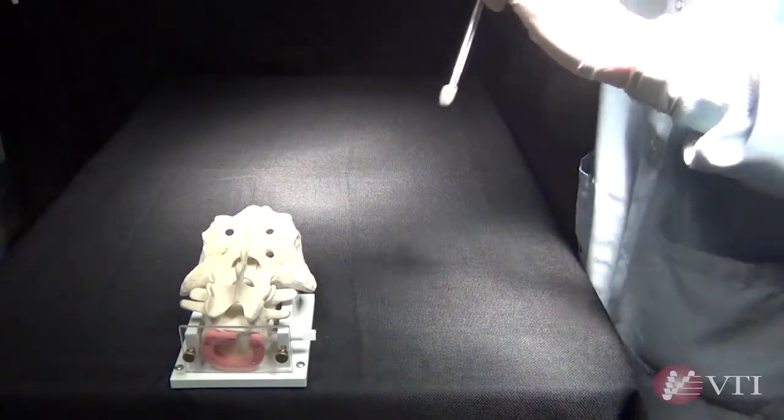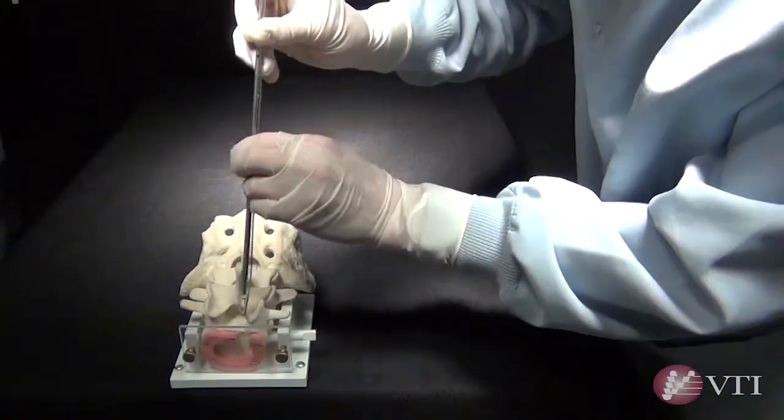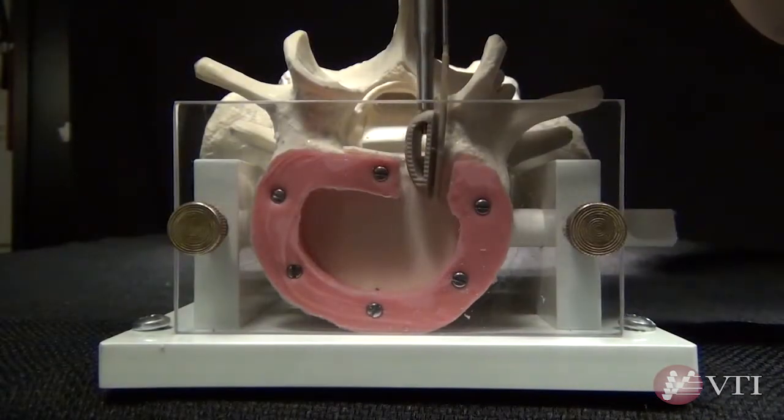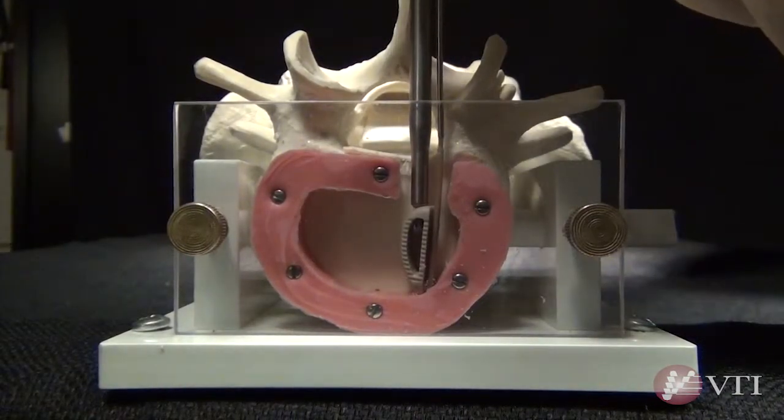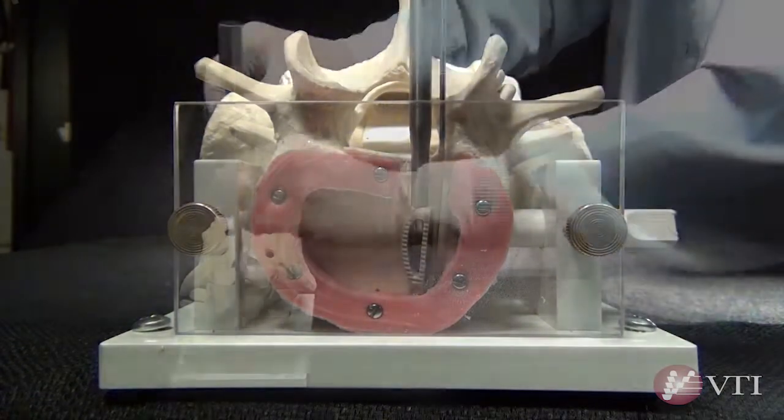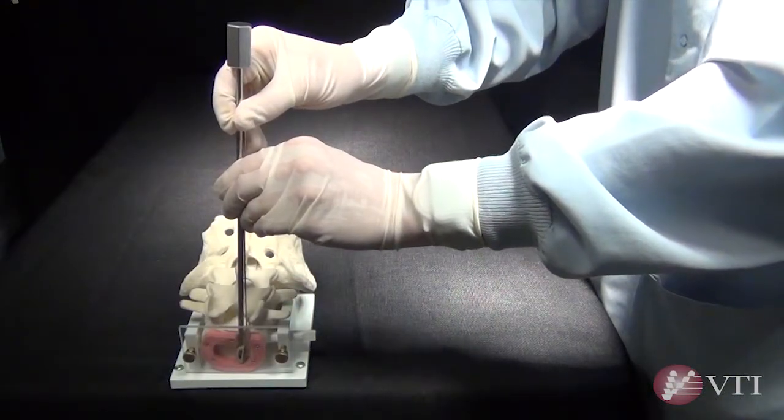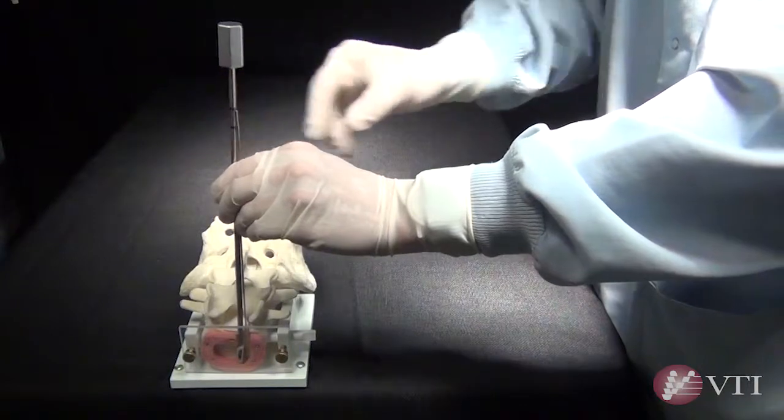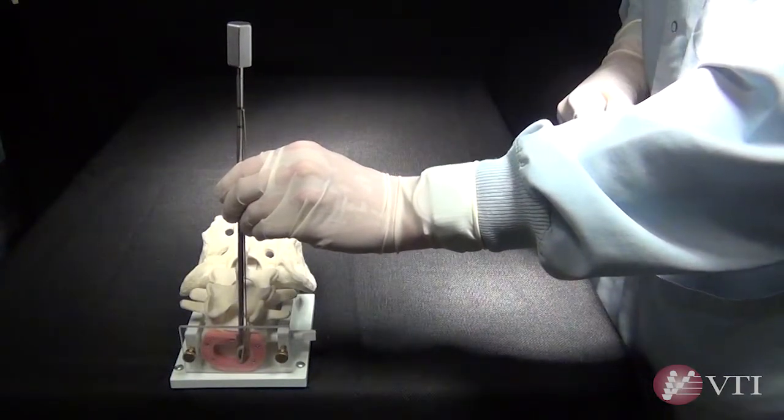The A segment is inserted into the disc space such that the serrated edges contact the vertebral end plates and the curved portion of the segment is oriented toward the contralateral side of the disc space. Once inserted, the tail of the segment and the threaded inserter will be protruding from the disc space.